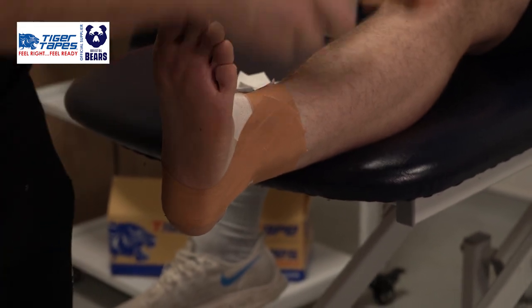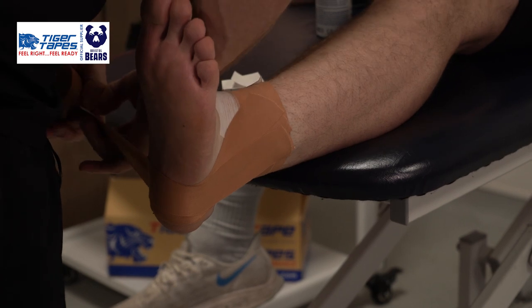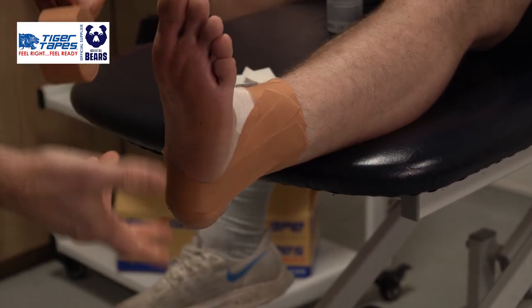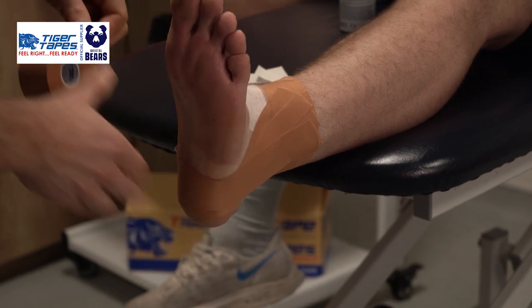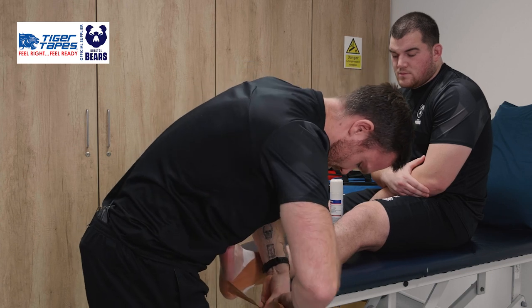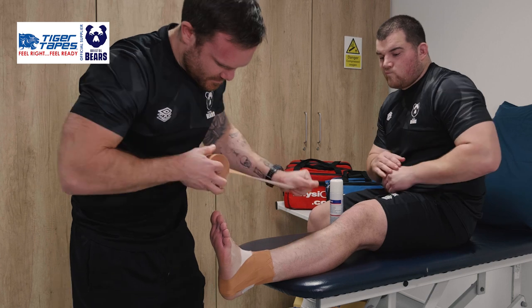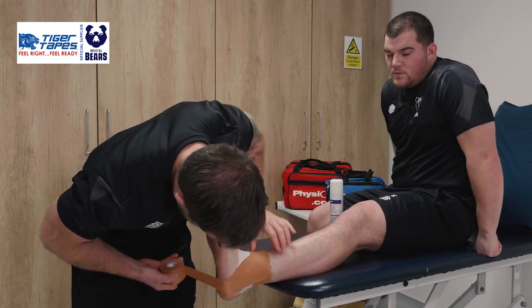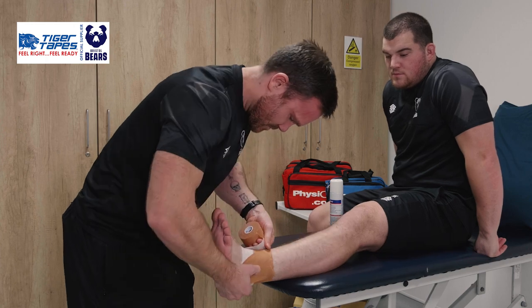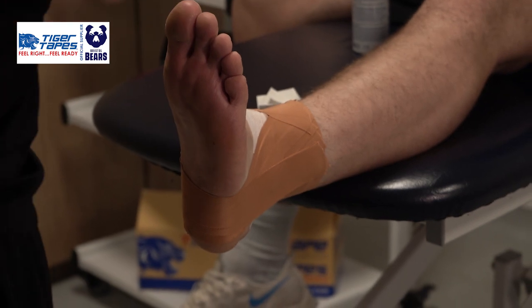And then working from lateral to medial. Really important with this strap is what we don't want to do is come too far down the foot, as that can pinch and actually give some people foot cramp. Often, a lot of guys also like a little bit more support through the front of that ankle just to block that talus.